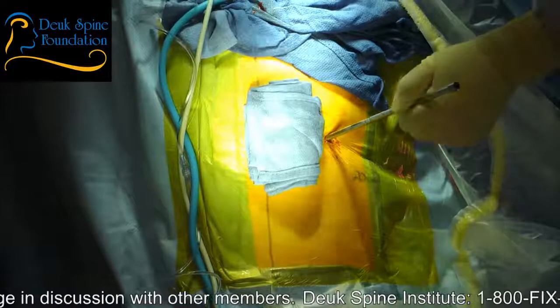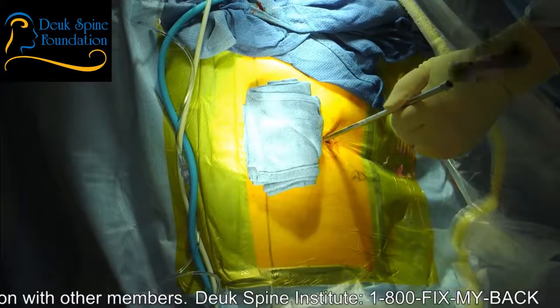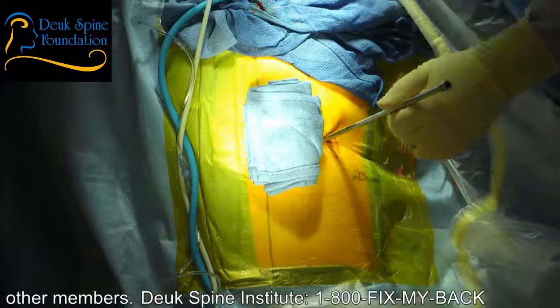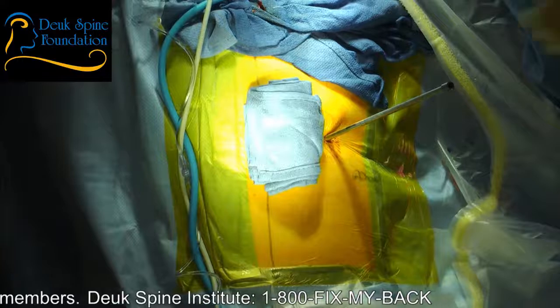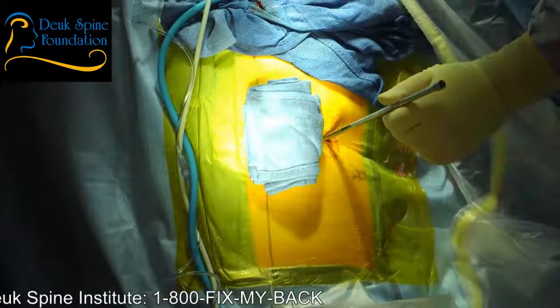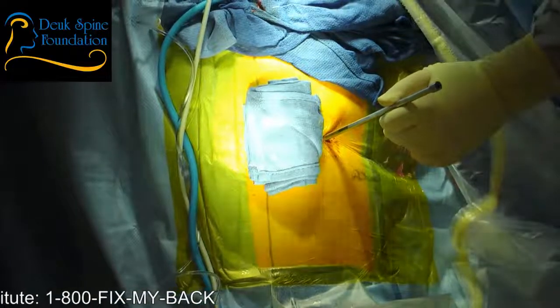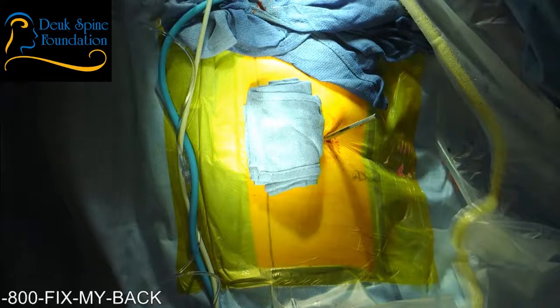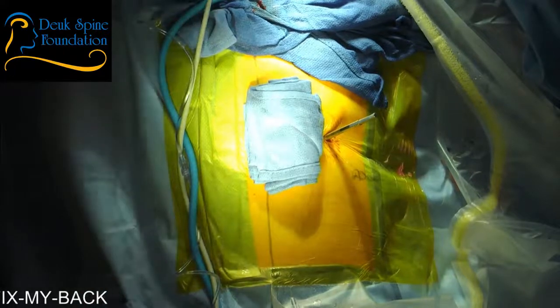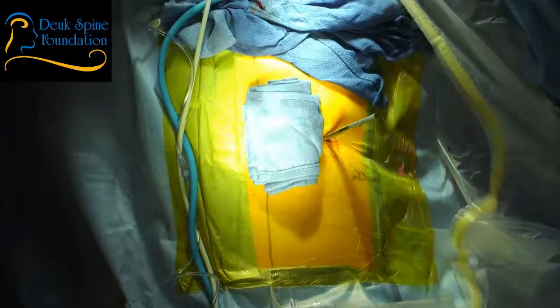Fortunately, I've never been in that situation. And we're very careful. Luis inspects every guide wire to make sure it's got structural integrity before we even use it. We throw away guide wires that are damaged. But that being said, it's something you have to take careful consideration of while doing the surgery, not to pinch the guide wire.